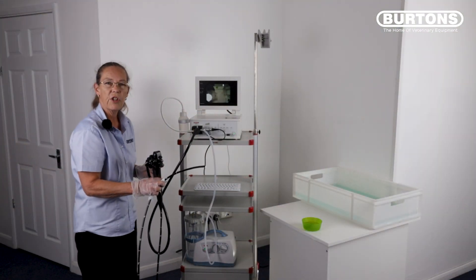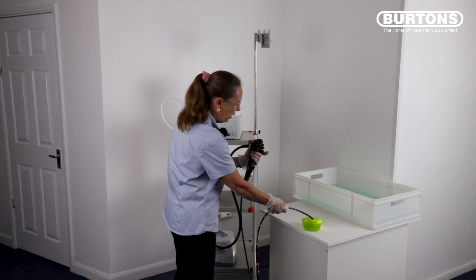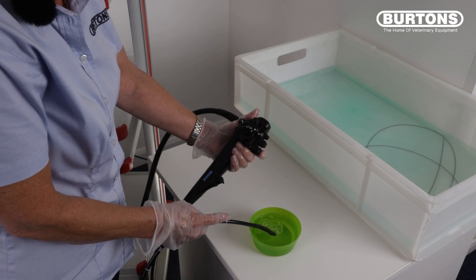You can now turn your suction unit off. With the pump still turned on, place the tip of the scope into clean water, cover the blue button and ensure you have a steady stream of air running through the scope.